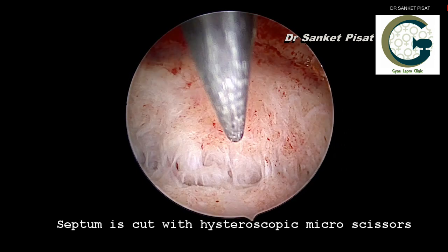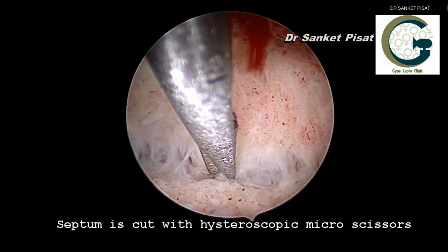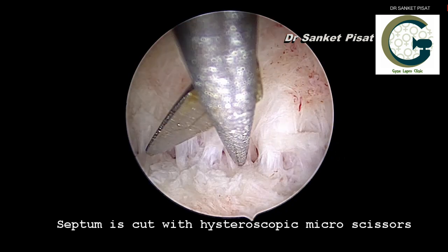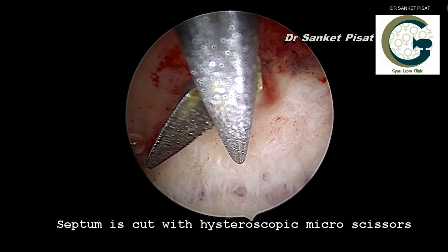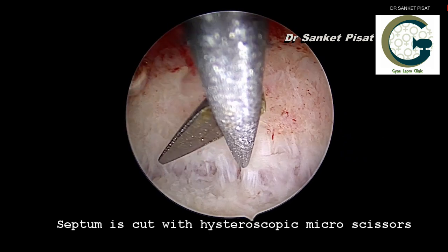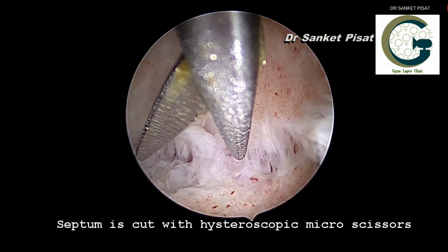The initial part of the septum is fibrous and does not receive blood supply, but as one goes deeper, more and more areas richly supplied with blood vessels are seen, which is a good sign. This means that the uterus is now getting back to its normal content and will be able to harbour the pregnancy because of this surgical correction.